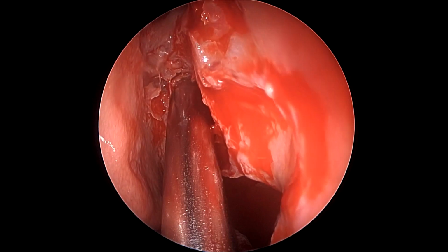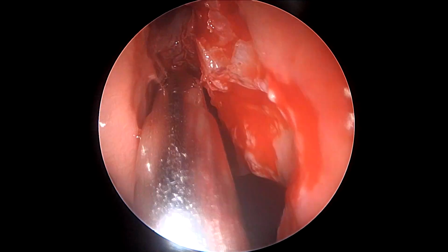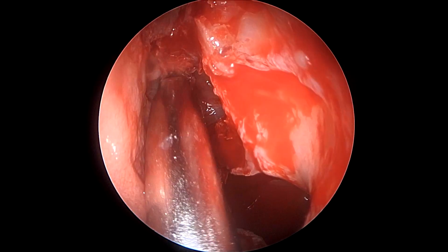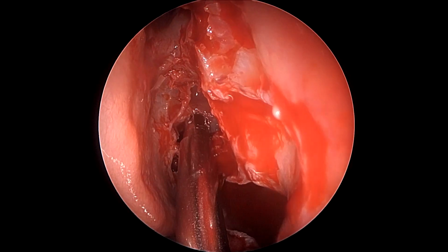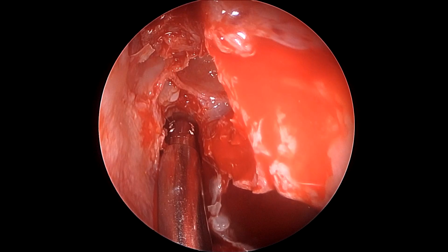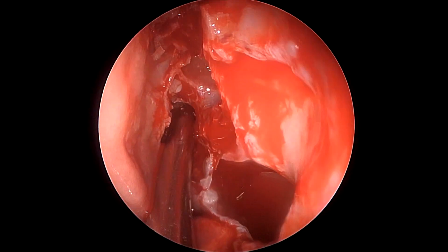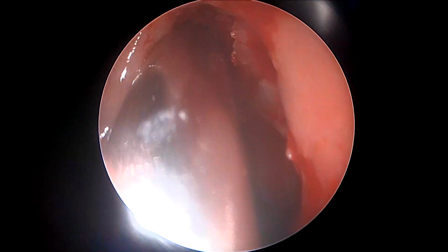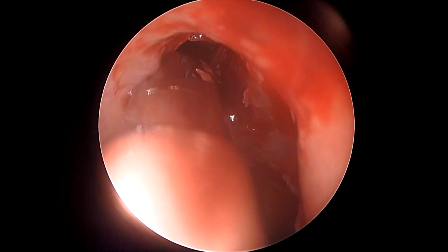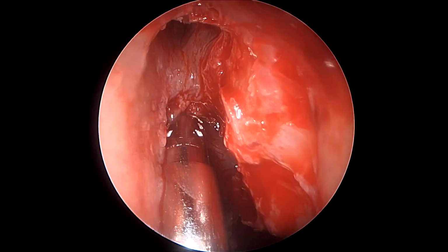Since it's a primary case, so it's polypoidal but not with any history of asthma or aspirin sensitivity or excessive polyposis, there seems to be a case for justifying a conservative sort of surgery to begin with as much clearance, but not causing excessive mucosal trauma or scarring, and not being too surgically aggressive. However, trying to achieve gross total removal of all ethmoidal septations and sinuses is fundamental to the success of almost all sinus surgeries, whether done for polypoidal or non-polypoidal disorders.